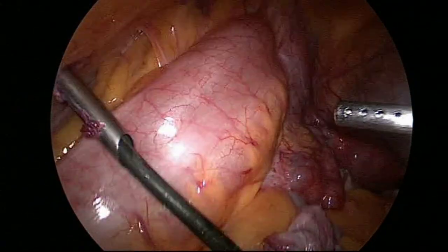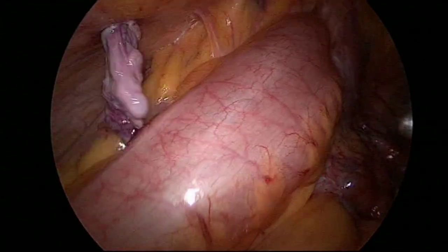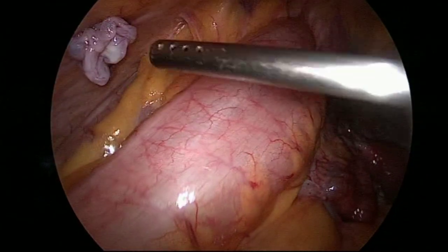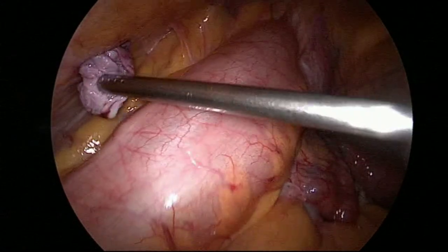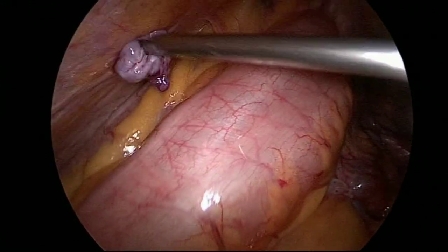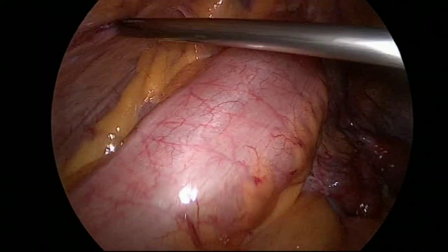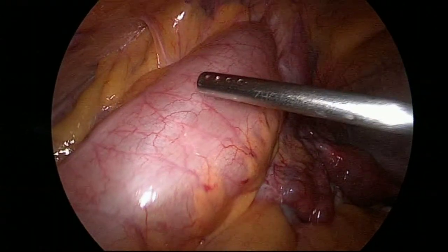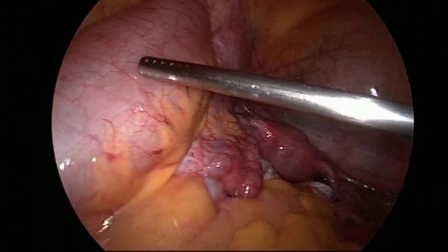Okay, I hold it from one side and now I am removing it with the port. Now it has come outside, my assistant is pushing from inside the peritoneal cavity and the cyst is gone outside. We did all the surgery by 5 mm ports except one camera port that is 10 mm.